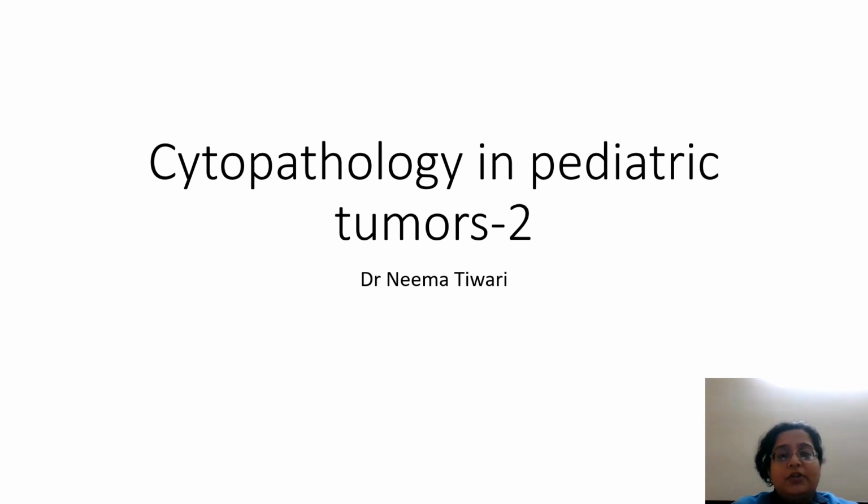Since this is cytopathology, we all know that we cannot give a 100% definitive diagnosis. We can only give a differential and then confirm it by molecular and ancillary investigations on the material available in FNA, or the best thing is to advise a histopathology diagnosis where the staging can also be done. Okay, moving on.